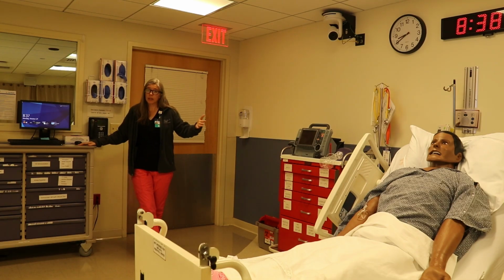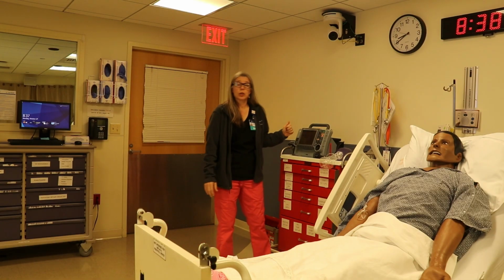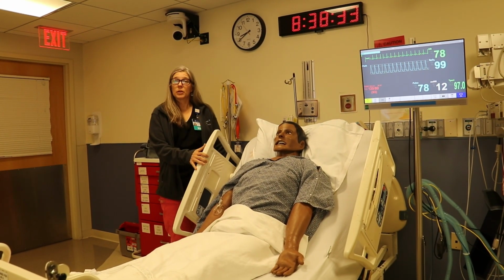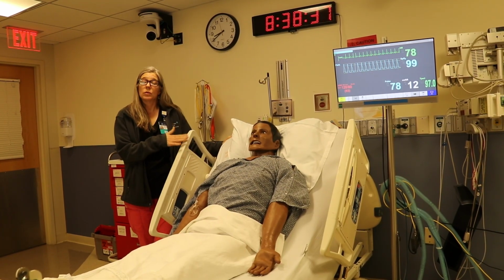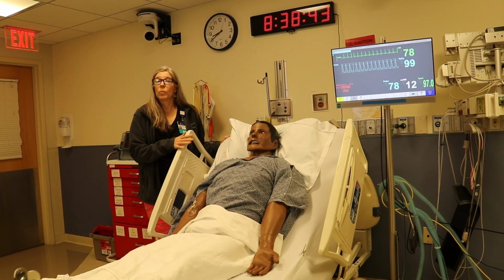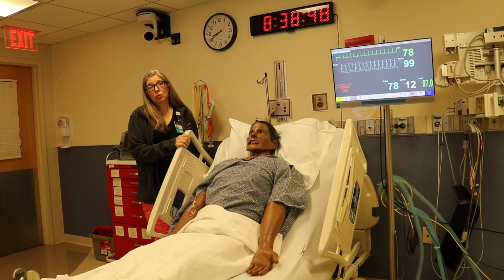Okay, we're going to move over here and talk a little bit about the code cart and the patient monitor. So in this simulation environment, we do have an older model bed, but it does have a CPR release function. So in the event you have something critical with your patient and you need to lower them quickly, you can use the CPR release function. When you go back to your clinical setting, you should take a moment to familiarize yourself with the beds that are in your clinical environment and make sure you know how to use the CPR release function.